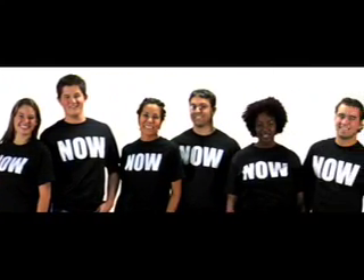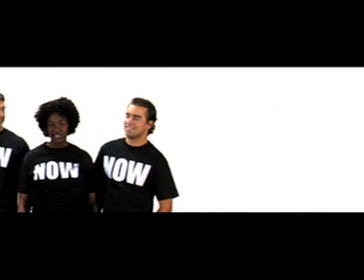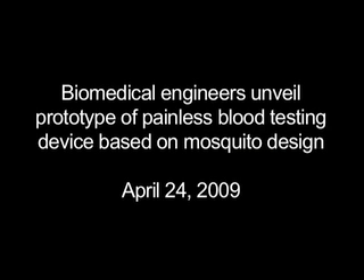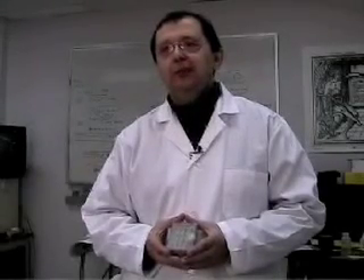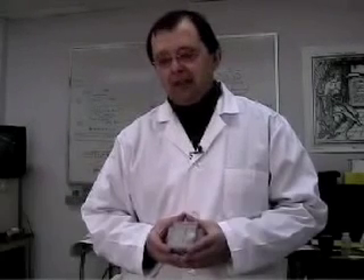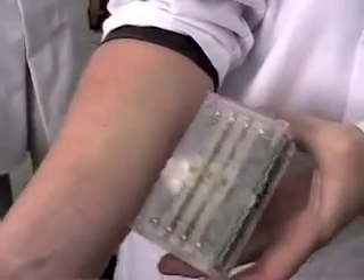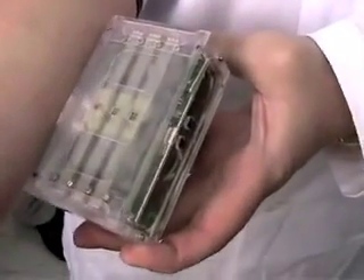Research that will change your world from the University of Calgary. The device I'm holding is called the Electronic Mosquito. It is a patented technology at the University of Calgary and the purpose of it is to provide sequential penetration through the skin of a microneedle to extract a blood sample and analyze the glucose level in it.